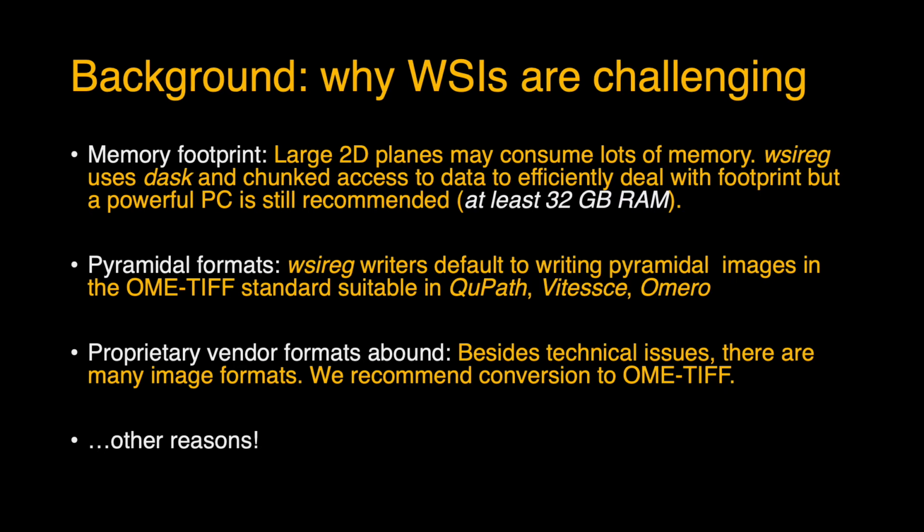So the way we deal with that is wsireg writes using standard pyramidal formats, so the OME TIFF standard, which works in QuPath, as well as other visualization software like Vitessce, OMERO, and anything that supports pyramidal OME TIFF, which is quite a few viewers now.